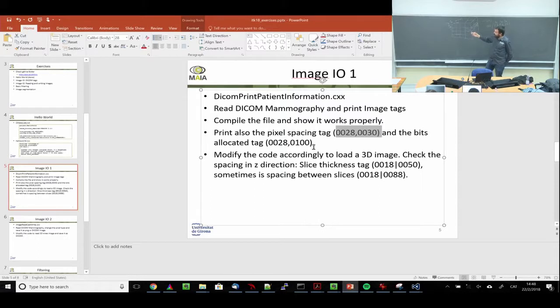That can happen as well. If different scanners have different sizes, you cannot rely on giving information in pixels. You always have to go into the physical coordinates, the physical world, let's say. Did I convince you?